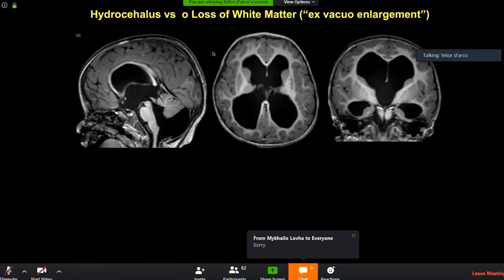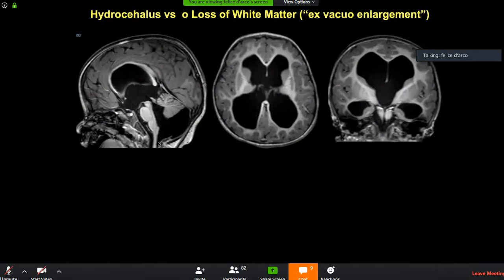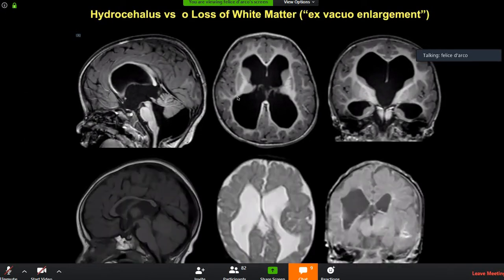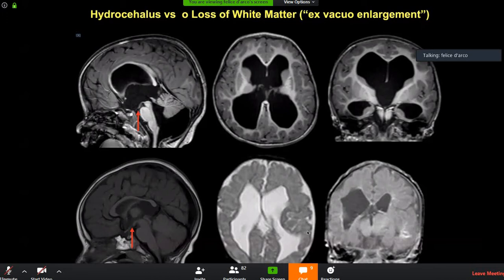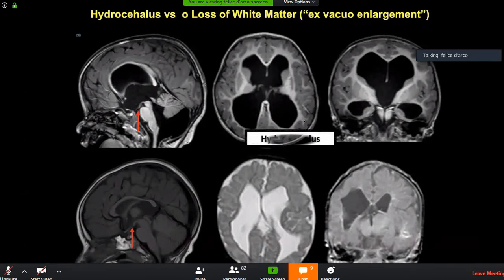There is stretching of the corpus callosum, bulging posteriorly and anteriorly, associated with this posterior fossa cystic malformation. This is an obstructive tetraventricular hydrocephalus with an ex-vacuo component. Completely different from this other case: the third ventricle here is flat, there is loss of white matter, some hemosiderin — this is white matter injury of prematurity. The squaring of the ventricular margins is very typical of ex-vacuo dilatation.